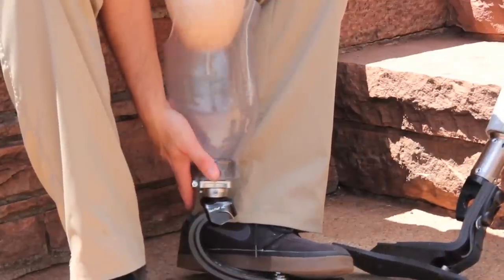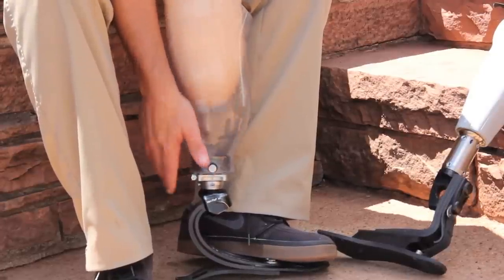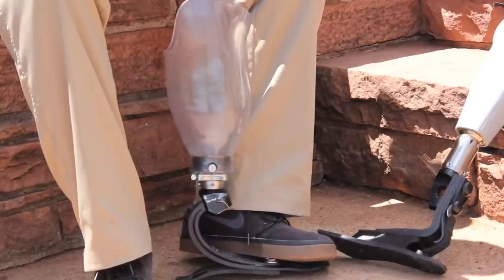To release the liner from the socket, a pin is compressed and held in, and the socket and limb are removed from the prosthetic socket.